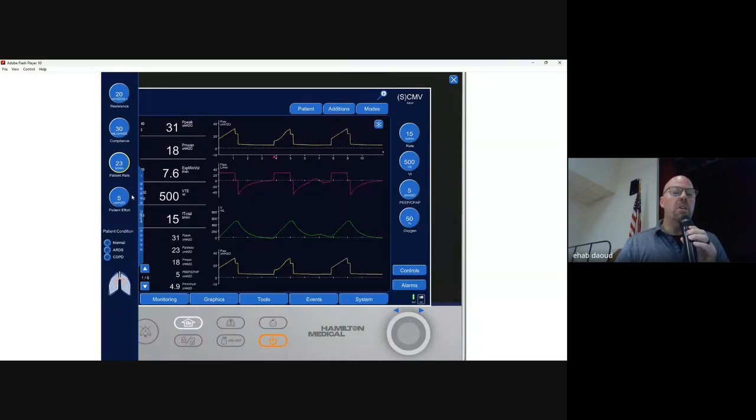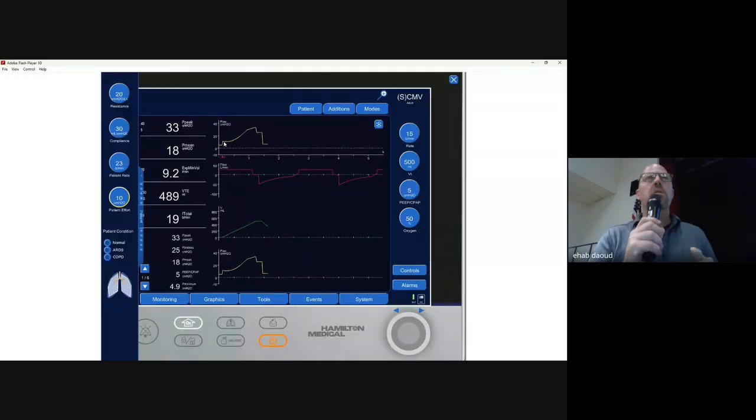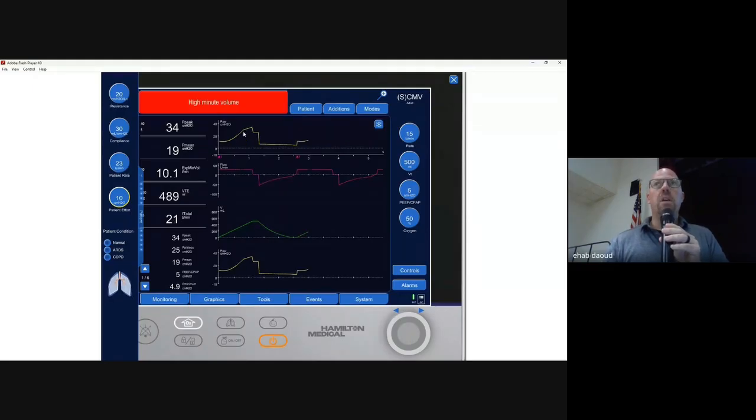And if I went over here to change the effort to simply show that the patient is having a worsening effort, ignore this because, all right, so here's the mandatory breath. Here's the breath of the patient. See this big scooping out of this pressure time curve? You would be surprised that after watching today, if you go back to your ICU units and you're using volume ventilation, how often this actually occurs because you don't have the tidal volume or the peak flow set correctly.